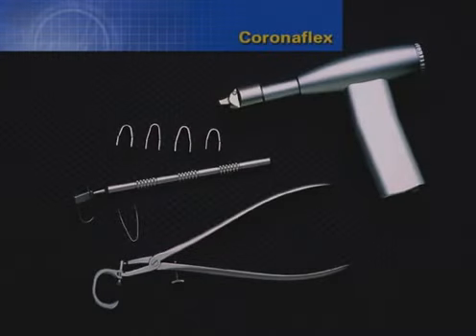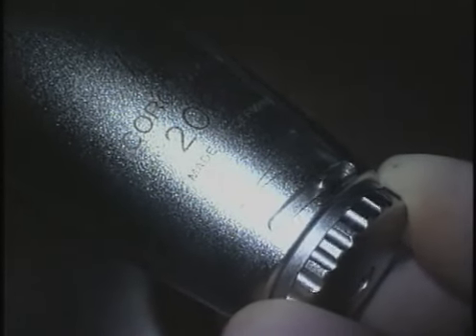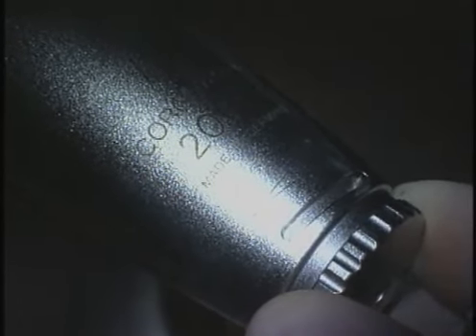The CoronaFlex is an air-driven device for the removal of full crowns and bridges. There are several intermediary devices, such as special pliers, a loop holder with loops, and variously sized clamps, all of which are used to engage the restorative. The power intensity of the CoronaFlex is determined by turning the knurled screw knob clockwise, which increases the magnitude of force to the hammer.